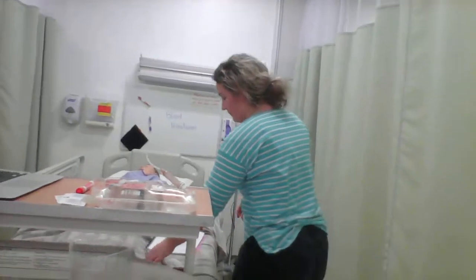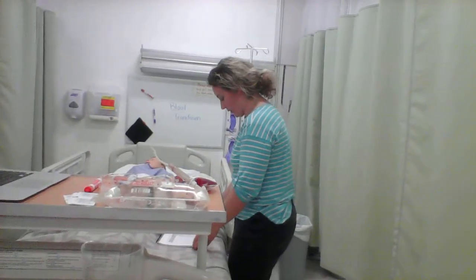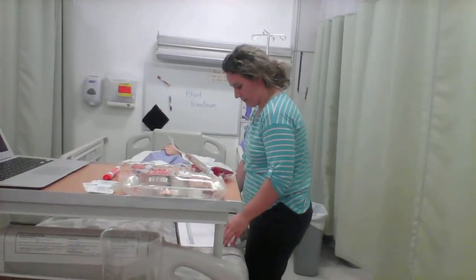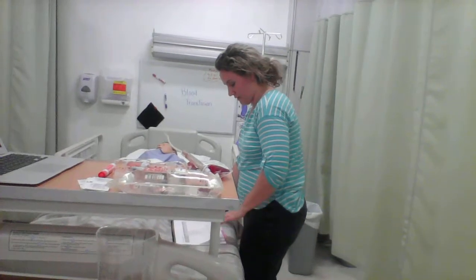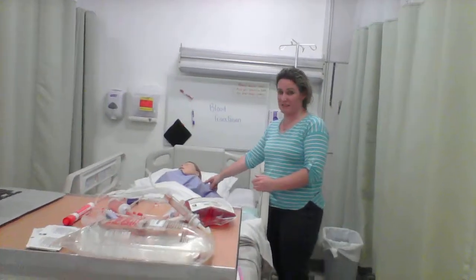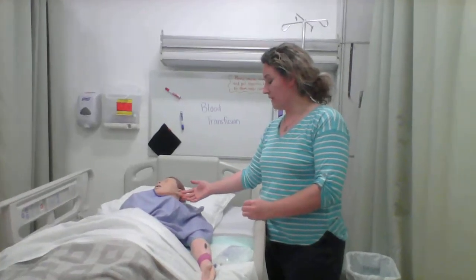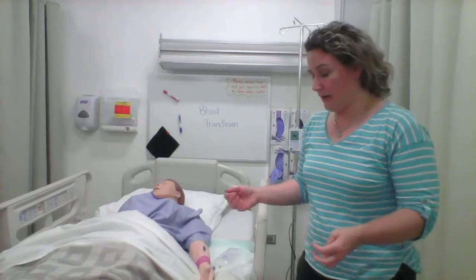Okay, Mr. Crowley, we've done everything we need to do to prep, so we're going to go ahead and start with the transfusion. The first thing: if the patient had a central line, I would apply a mask and put it into the distal port, which is the brown port, and I would verify that it was patent through a flush.